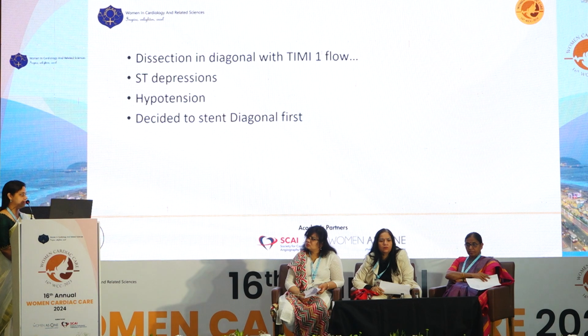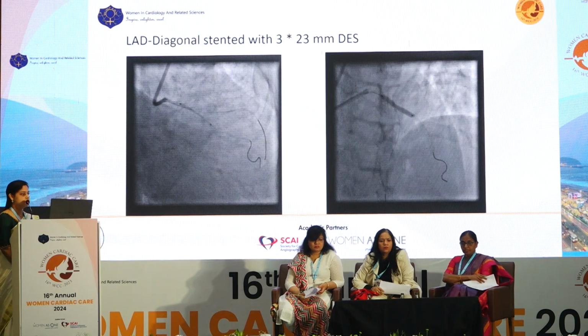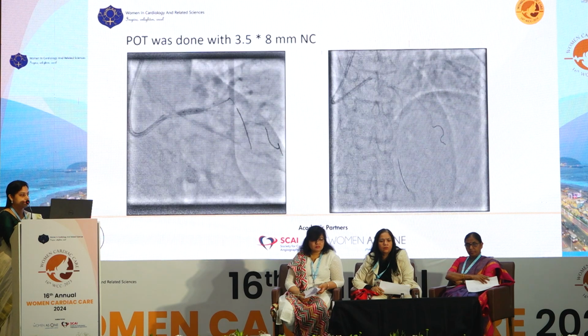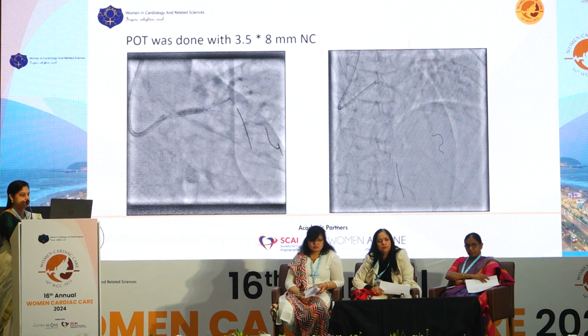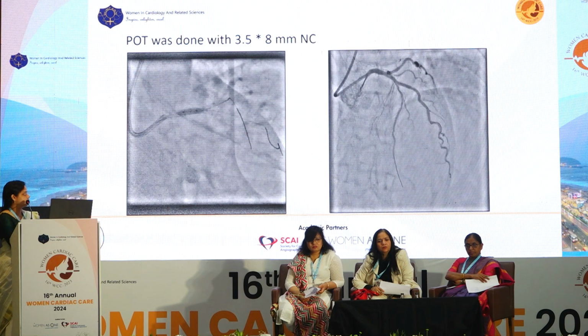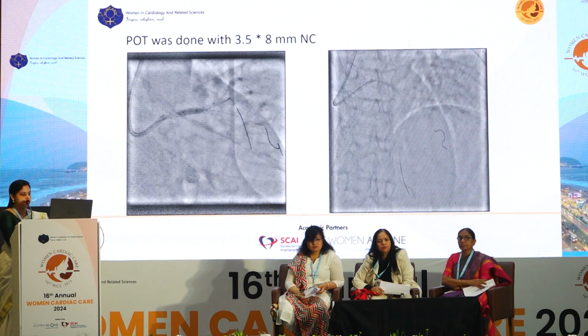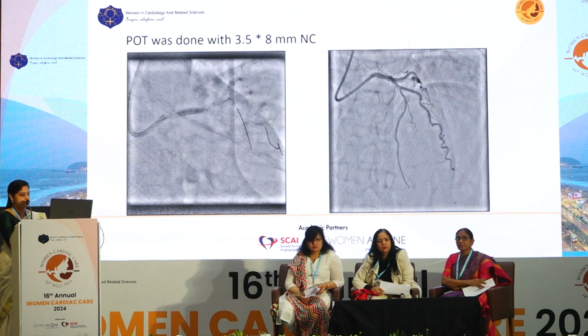Unfortunately, I don't have that fluoro image. So we decided to stent the diagonal first. So LAD to diagonal was stented with a 3 into 23 mm DES. Then POT was done with a 3.5 NC balloon. So this was the result after LAD diagonal stent. The ostium of LAD was compromised.